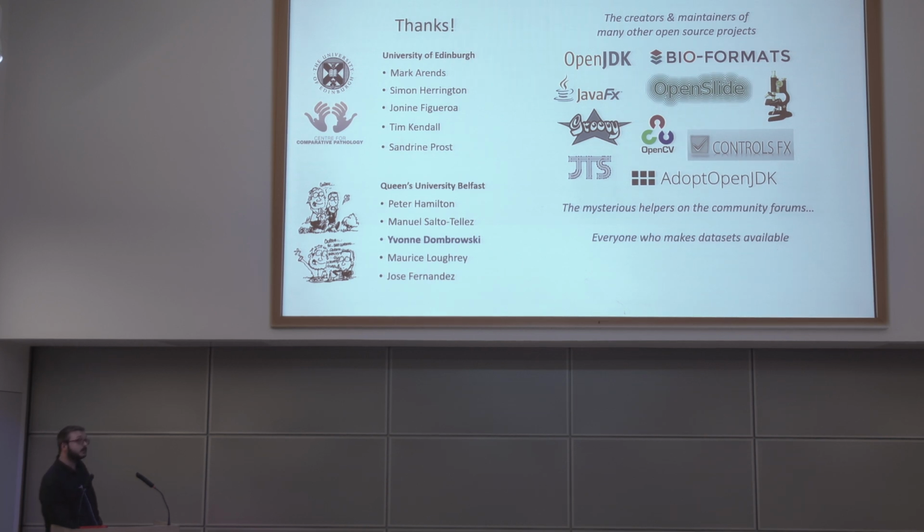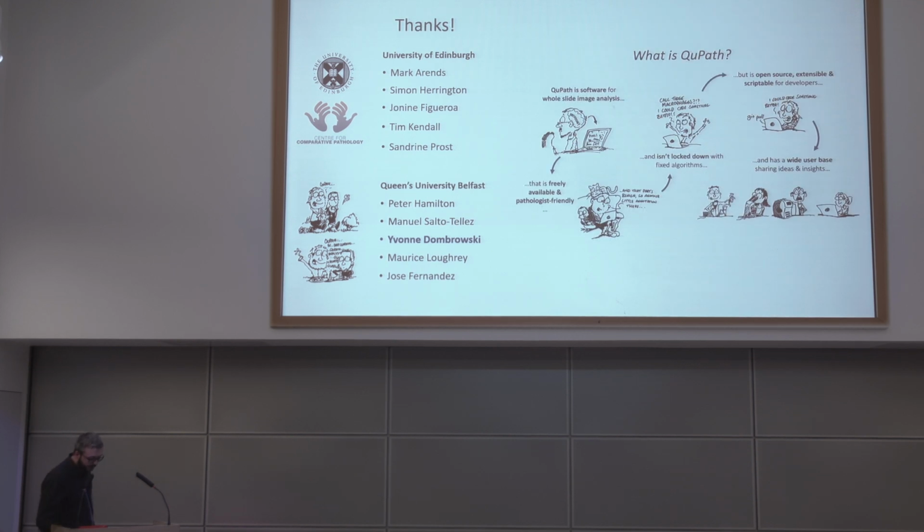It's an open source project, so it relies on other people's open source libraries as well, like OpenSlide and Bio-Formats to help read the images, OpenCV for some image processing techniques. And so, yeah, it's part of the open source community.